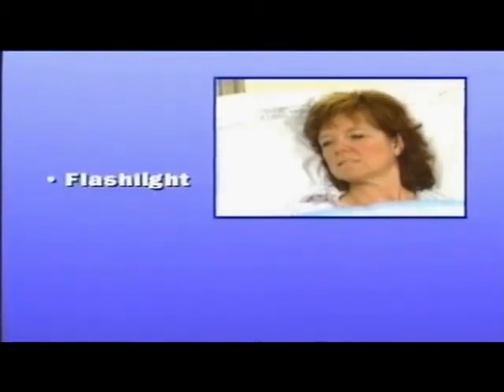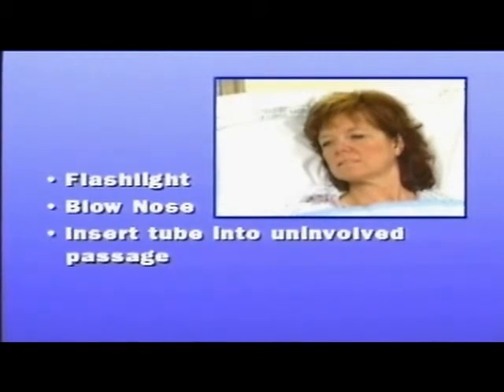A small flashlight can be used to observe any obstructions. If the patient is able, have them blow his or her nose. The nasogastric tube should be inserted into the uninvolved nasal passage or the side with the greatest airflow.